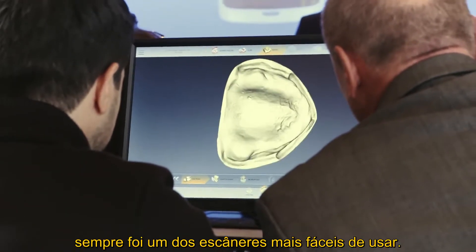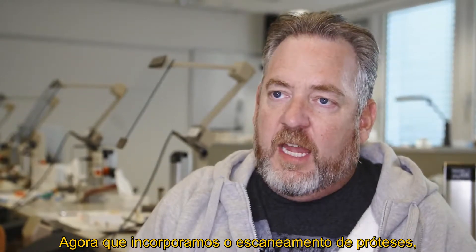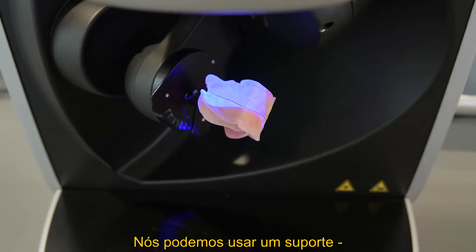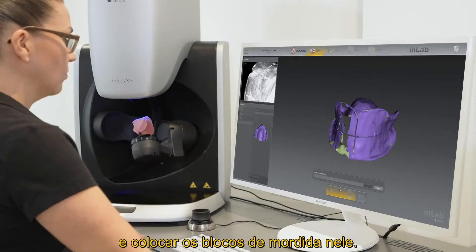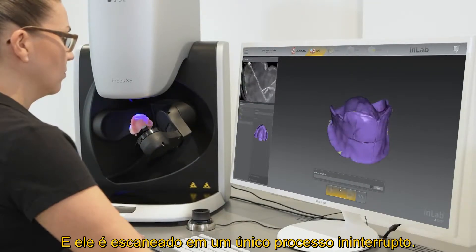The inEos X5 scanner has always been one of the easiest scanners to work with. Now that we incorporate the denture scanning, it's a really simple flow. We have the ability to use a holder and put the bite blocks in there, and it just scans in one seamless flow.